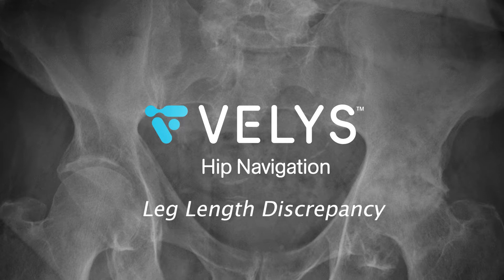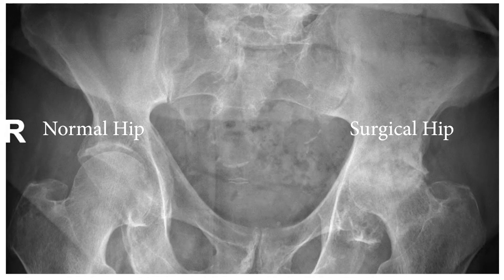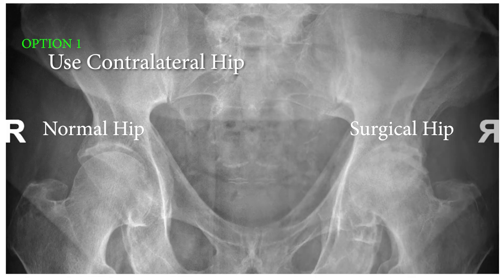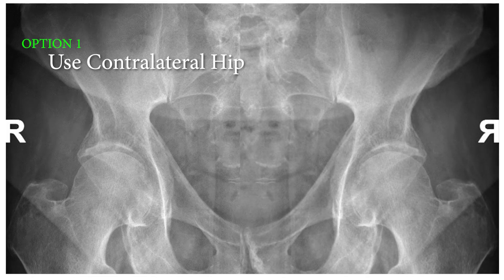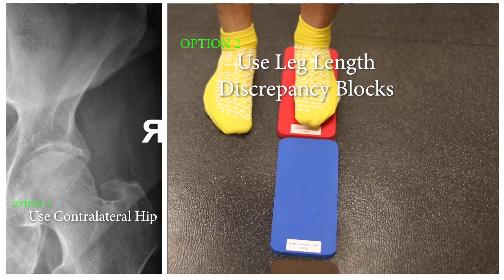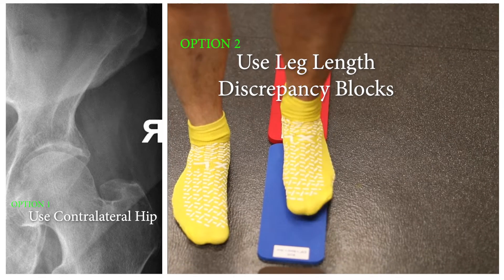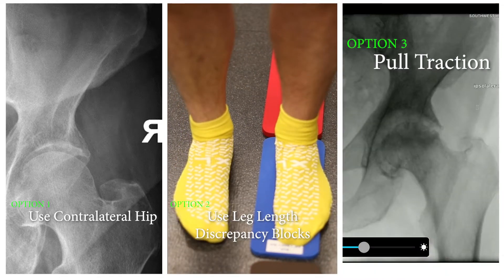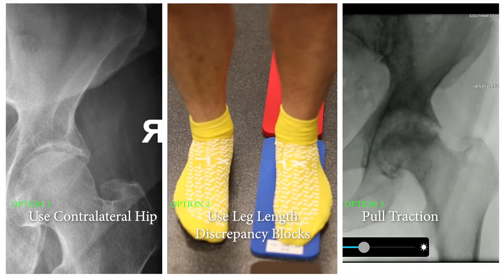This video is a case example of using VELYS hip navigation to optimize leg length in the setting of a significant leg length discrepancy. There are three different ways to use the VELYS software during surgery to obtain leg length data to make an intraoperative decision for final implants. I will use all three methods here in the same surgical case to demonstrate the breadth of the VELYS software, using the same progression as at the time of surgery.